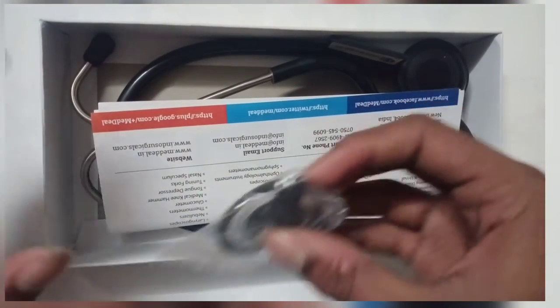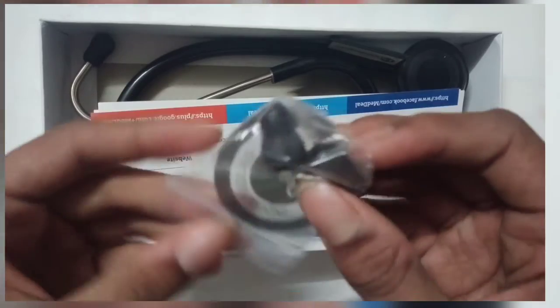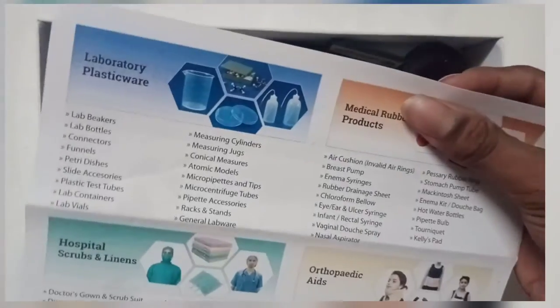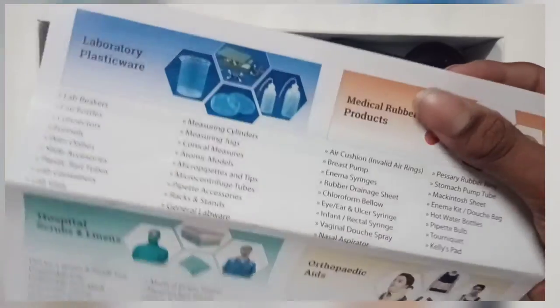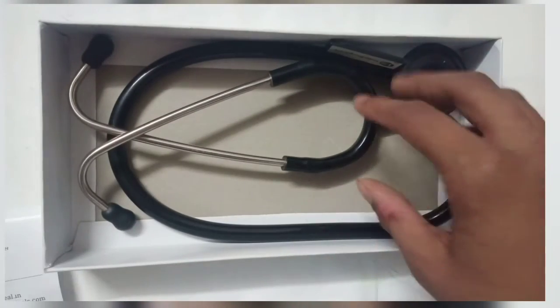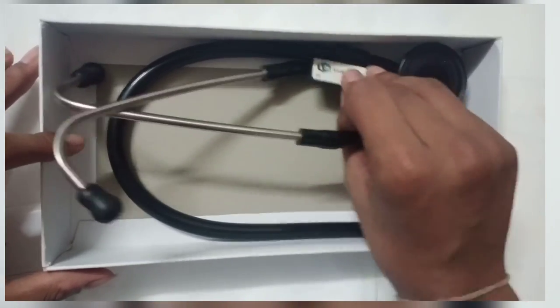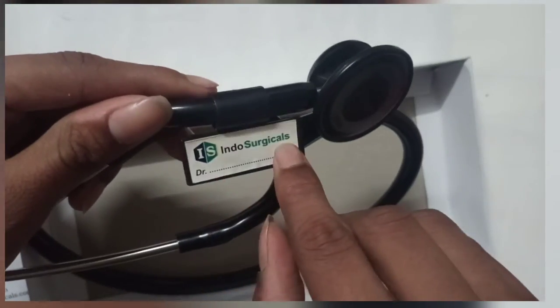We get 2 ear cups and this. This is my new toolbox. This is another item from this company which they provide us. This is the Stato Scope which we get. This is the Indosurgical branding.